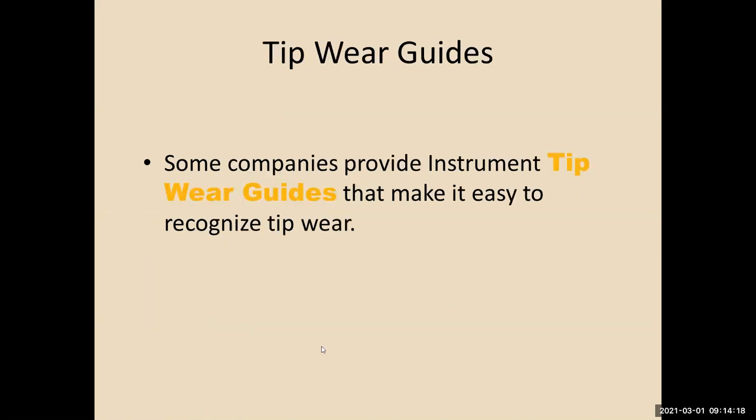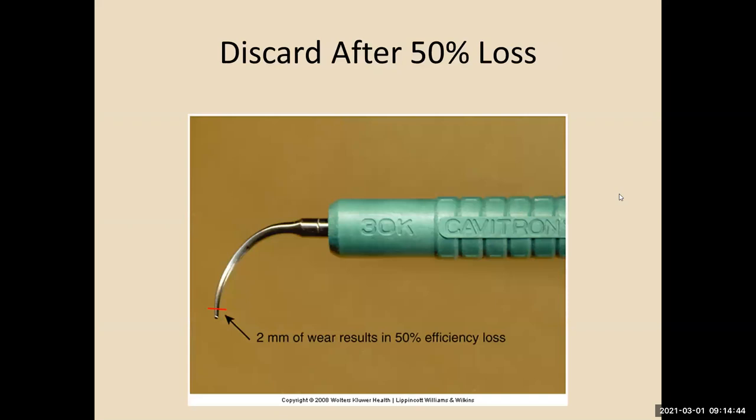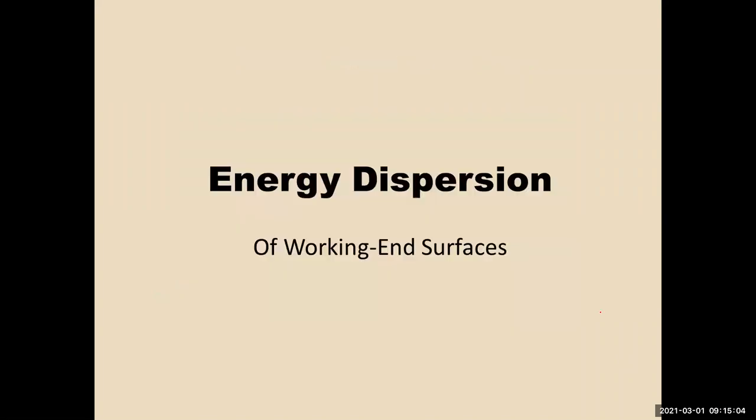So there's something called a wear guide. This one is from Hu-Friedy, and you put the instrument on here, and then you can check to see if it's a 1 millimeter or 2 millimeter decrease. Again, 1 millimeter is 25%, 2 millimeters is 50%. You're wasting your time. So they do wear. 2 millimeters of wear results in 50% efficiency loss. And I've seen, especially when I've been temping, some really bad nubs that look like they're worn down to about here. And it's like, well, what am I supposed to do with that?